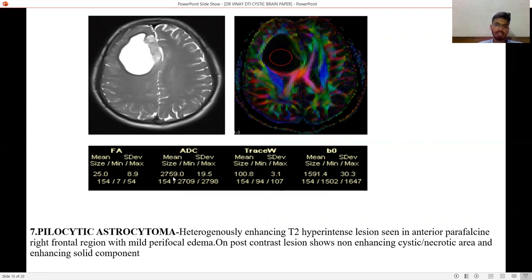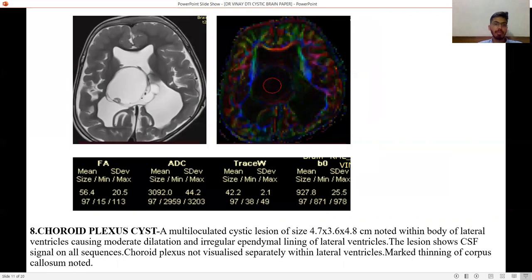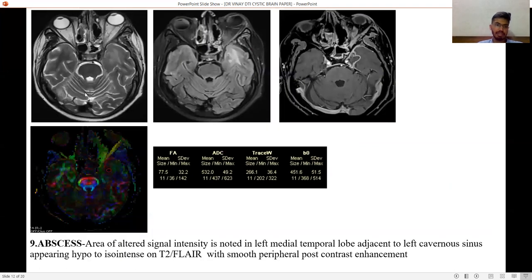ADC value is higher in this case due to the cystic nature. Next, choroid plexus cyst — a multi-lobulated cystic lesion noted within the body of the lateral ventricle, causing moderate dilatation and irregular ependymal lining. The lesion shows CSF signal on all sequences. Choroid plexus is not visualized separately within the lateral ventricle, and marked thinning of the corpus callosum is seen.